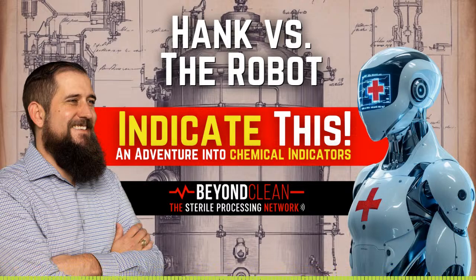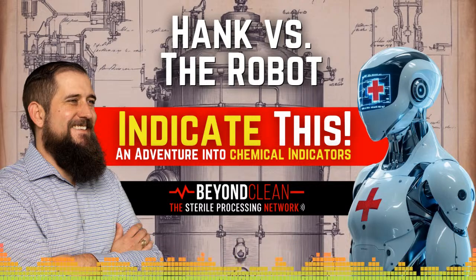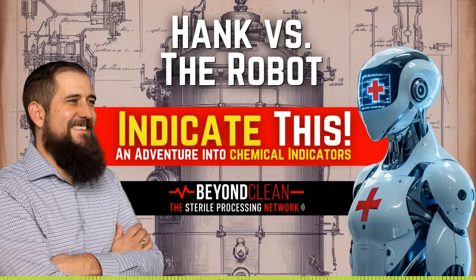Integrators, being multi-parameter, are inherently better at minimizing false passes because they simulate sterility conditions more comprehensively, but even they rely on careful use. It's like a chef tasting one spoon of soup to decide if the whole pot is good. If that spoon doesn't represent the whole batch, or if it's not working properly, you're flying blind. And in SPD, that's a risk we just can't afford.